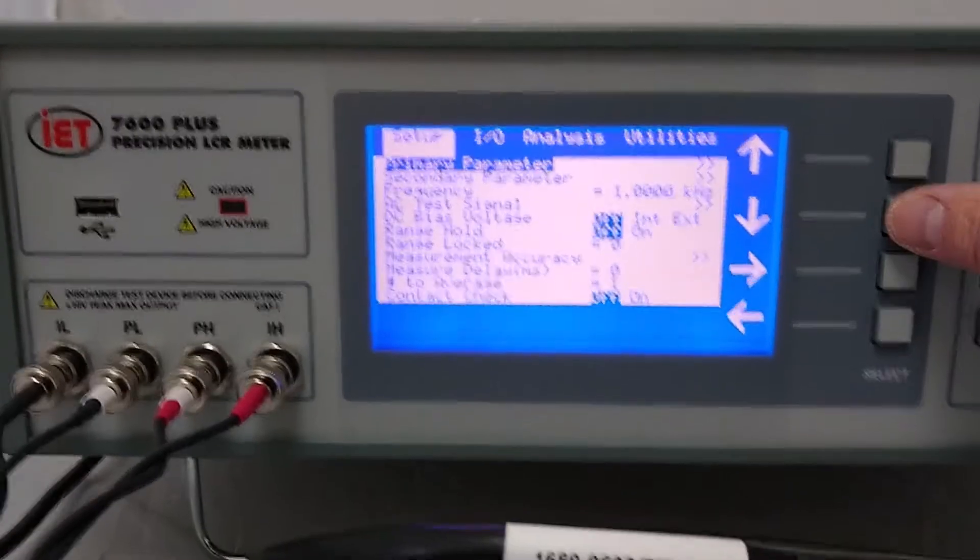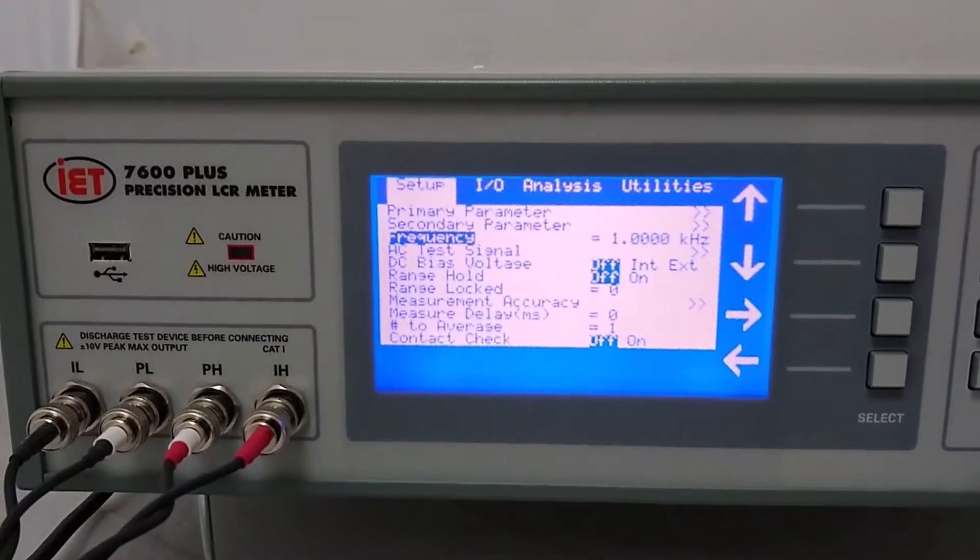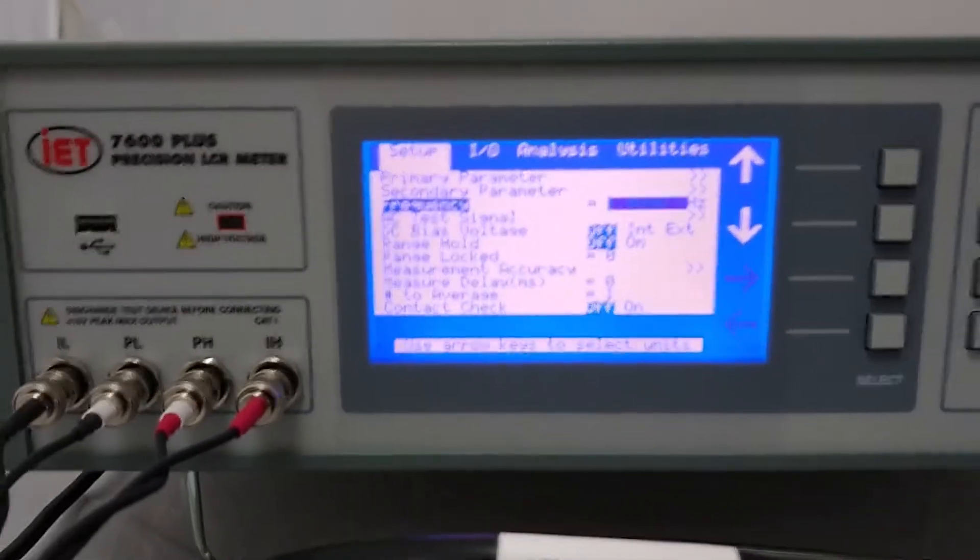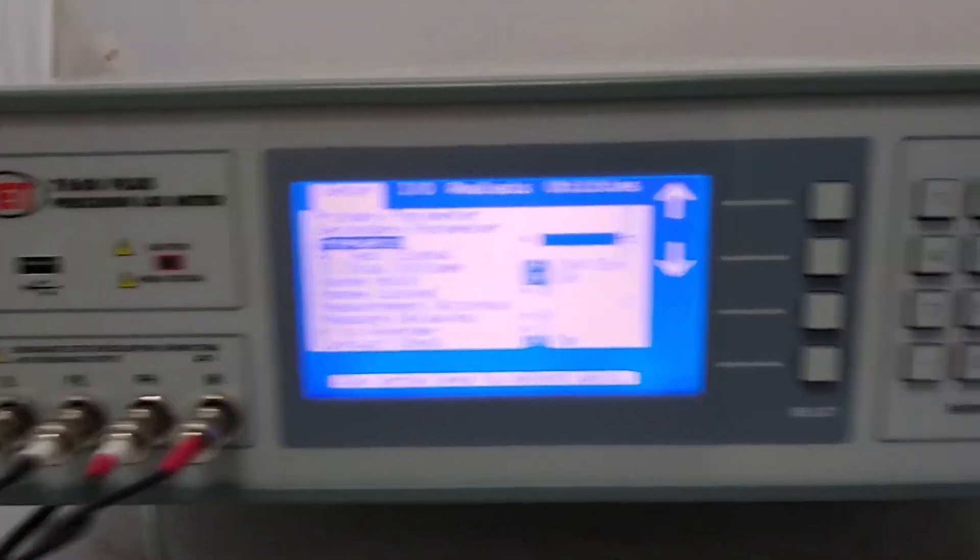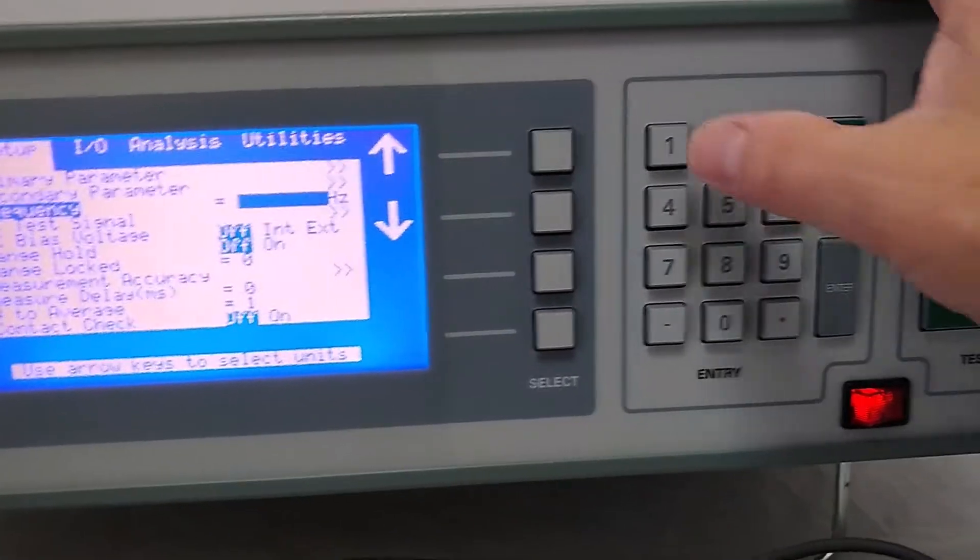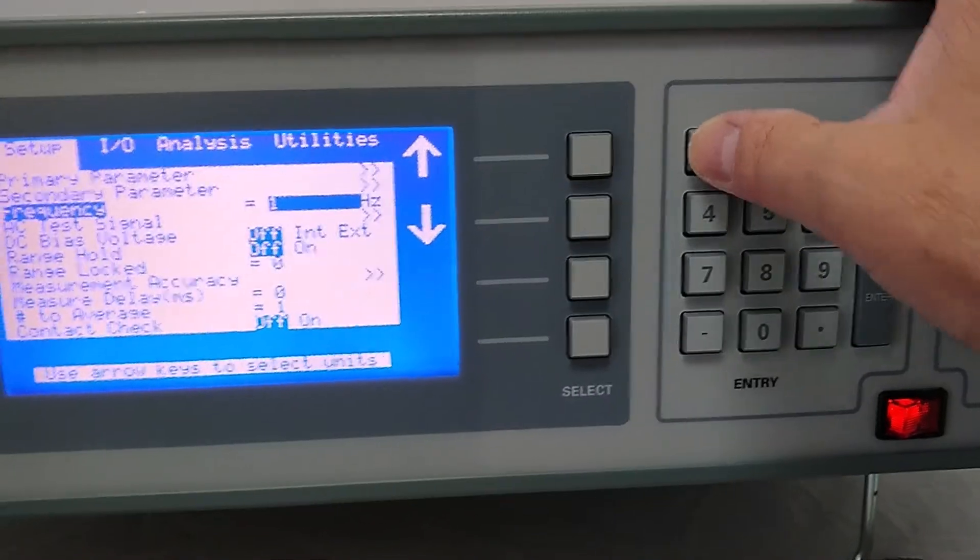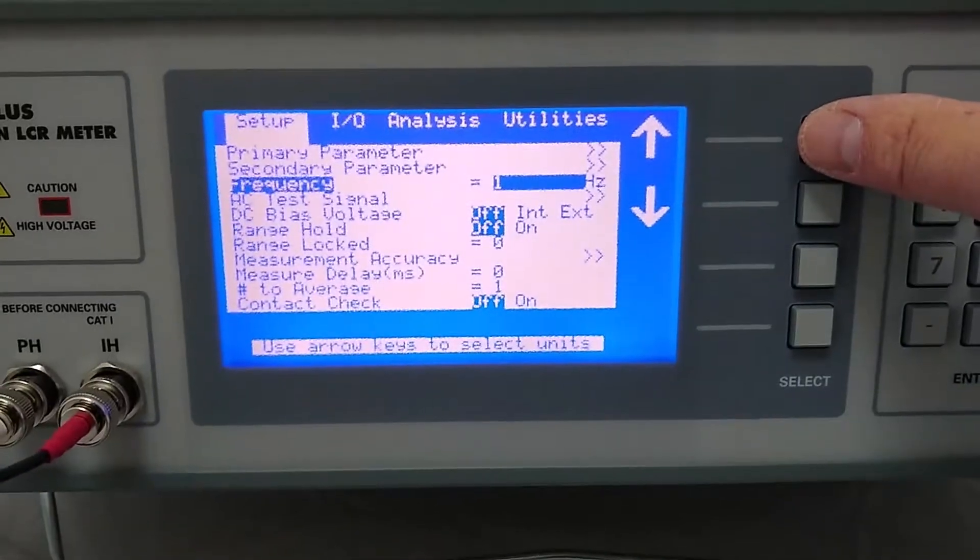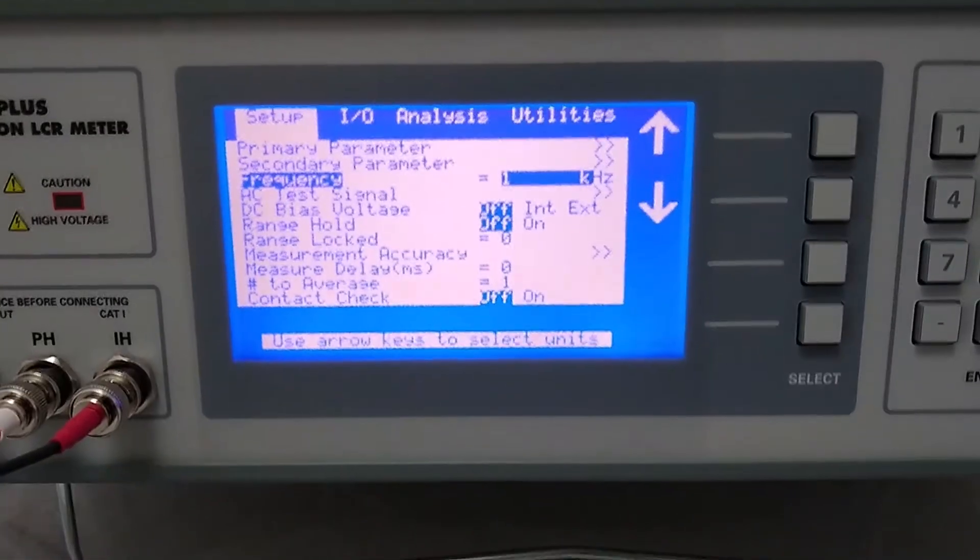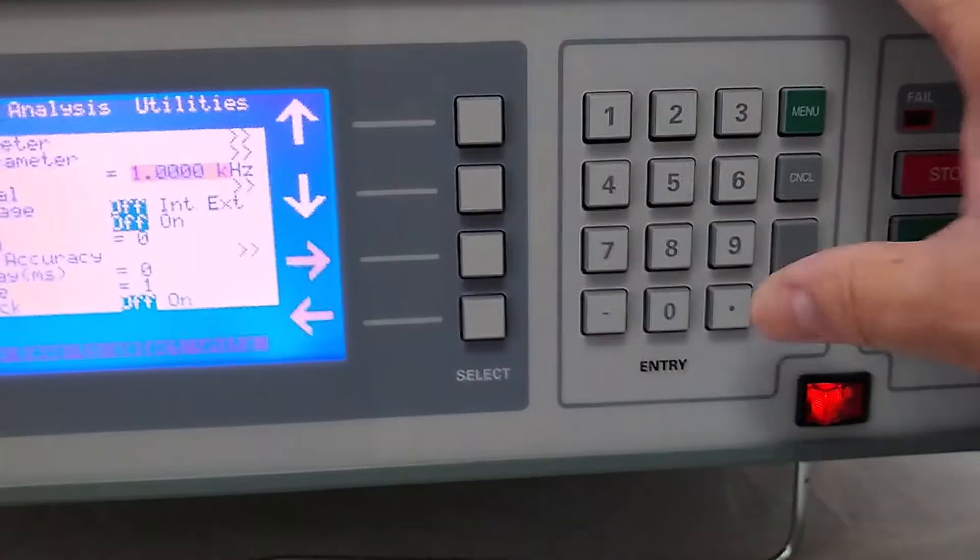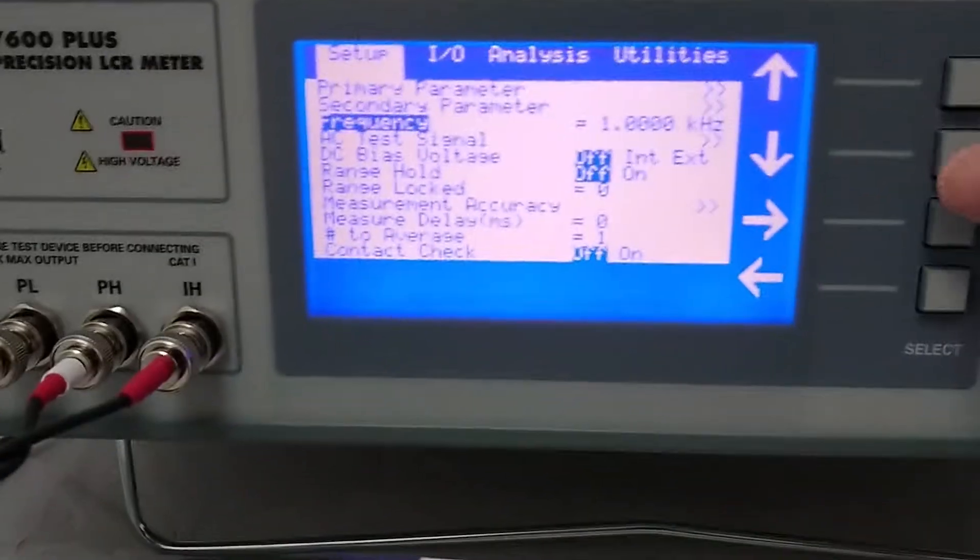From a setup standpoint, the only thing you should really have to do is go down to frequency, enter, and set in the frequency using the keypad. In this case we're just going to enter 1 kHz. 1, and then we can use the up key to enter K, kHz, and press the enter button. It enters in 1 kHz.